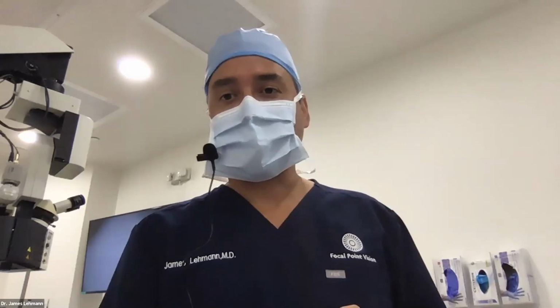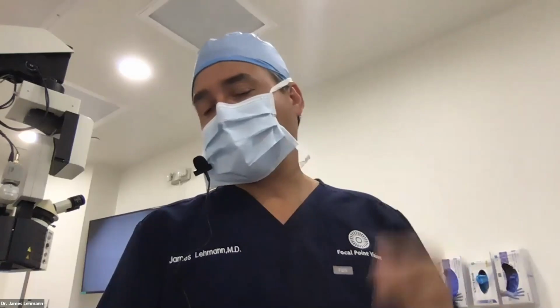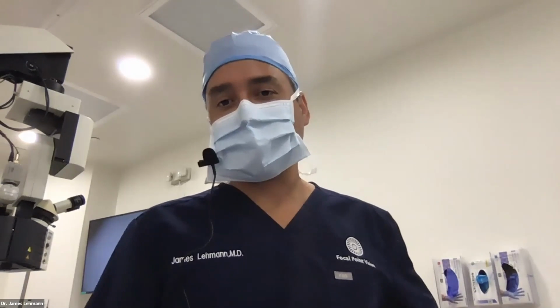Can Femto cut black hard cataract? It can try. I don't think it would do a great job, but it can try.